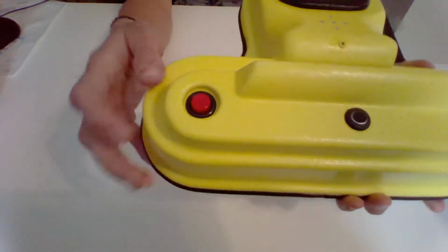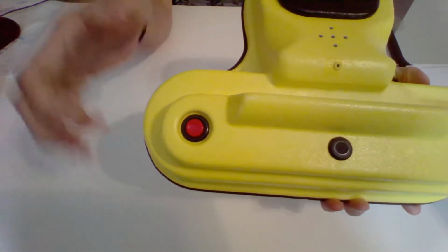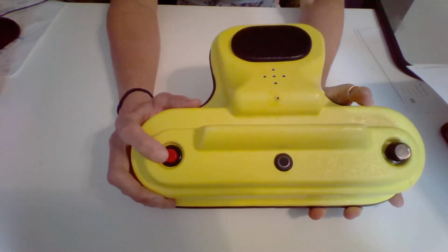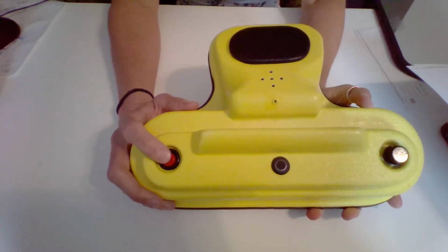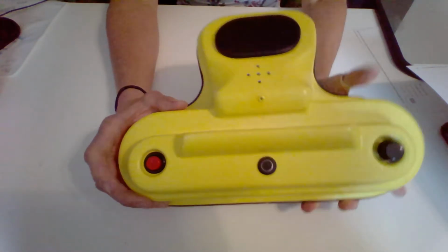All right, on this side, you have a red button. This is your recording button. I'm kind of glad it's red, I'm not going to lie, because that kind of clues you in if you throw the instructions away like I do. Later on, you go, how do I record on this thing again? You think, red button, record. Yes, that's right. So pretty user-friendly there.